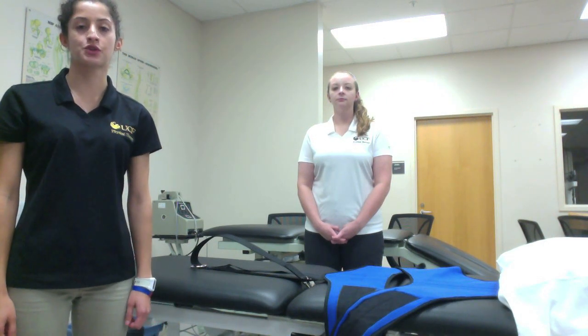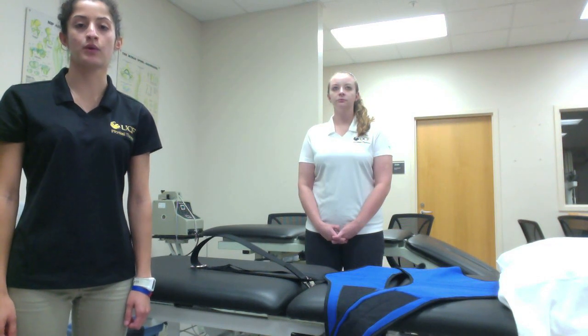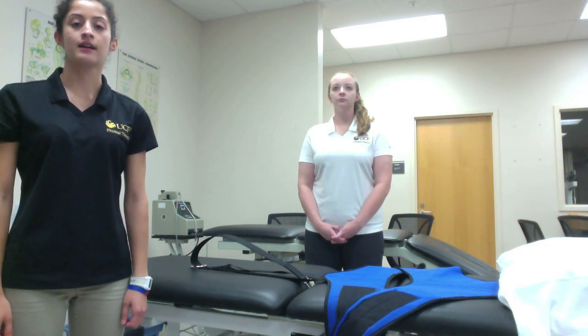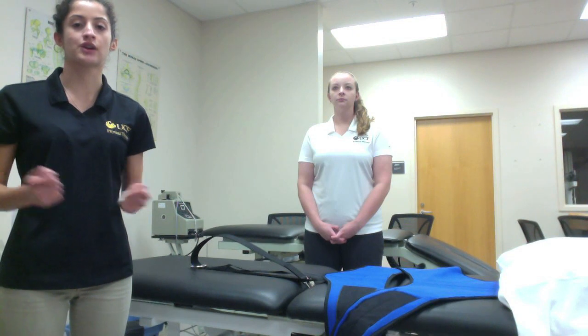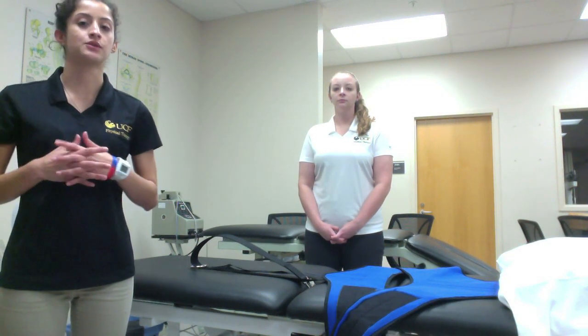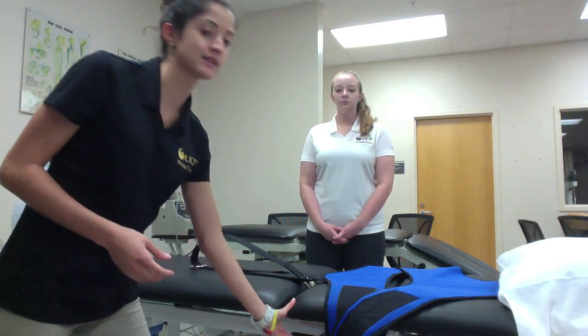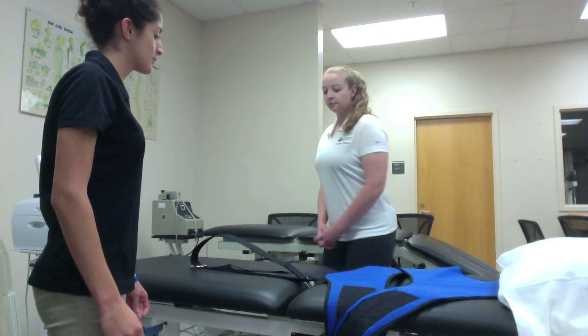The benefits of this treatment are to have a well-controlled traction force and time, a longitudinal pull to decrease the pressure, and a distraction force to create a distraction of the facet joints, as well as increasing the soft tissue extensibility. Prior to the patient getting on the table, I want to make sure that it's locked, which it is now. I'll have you go ahead and lay down for me.